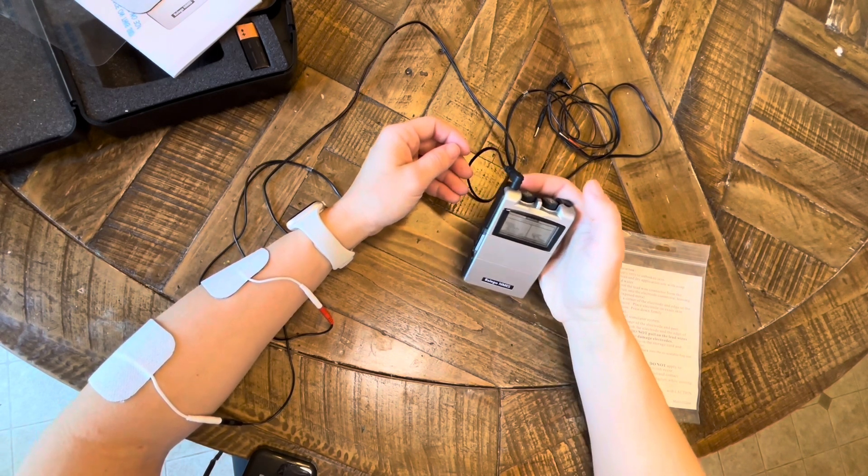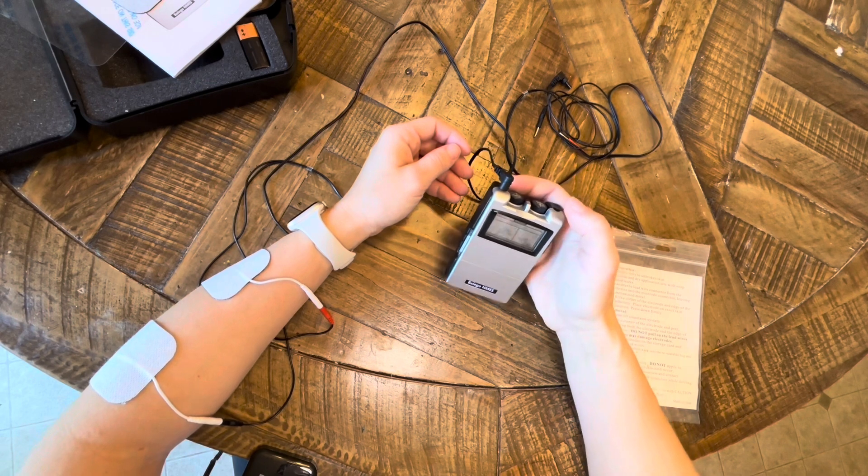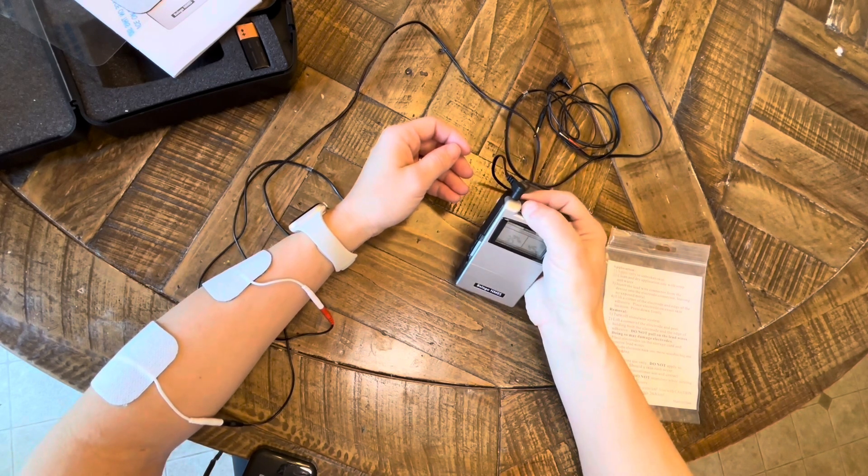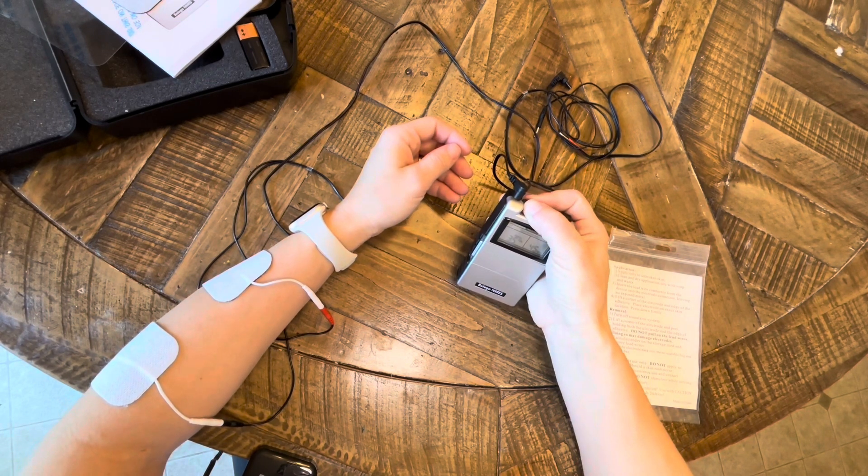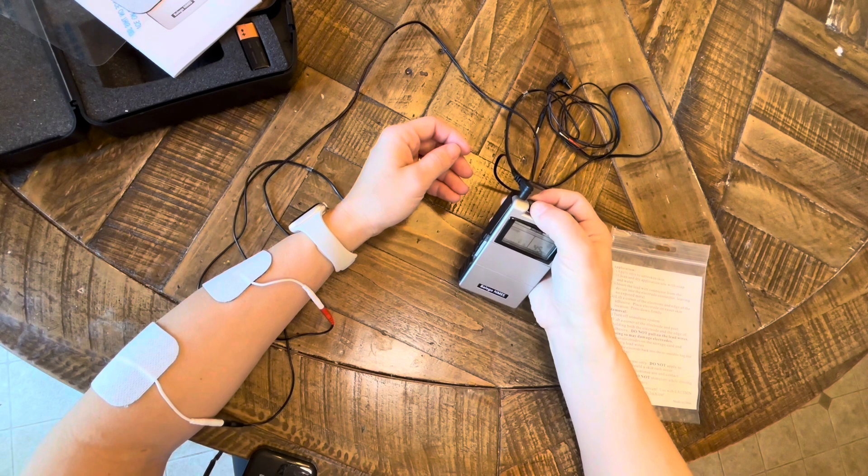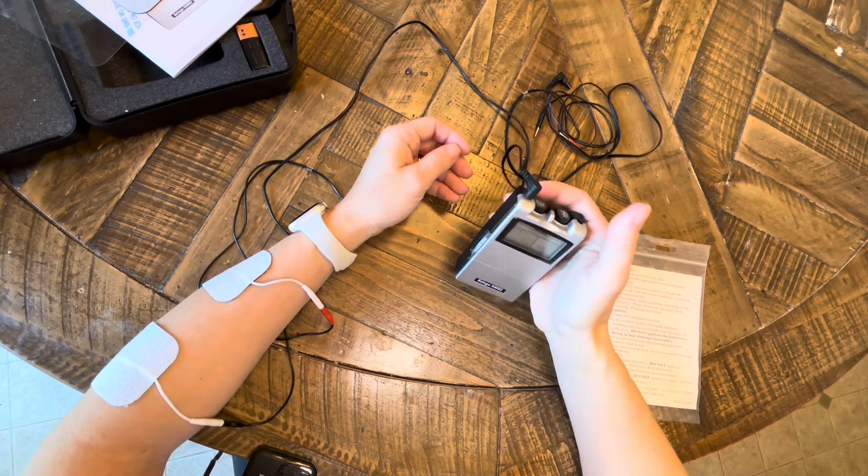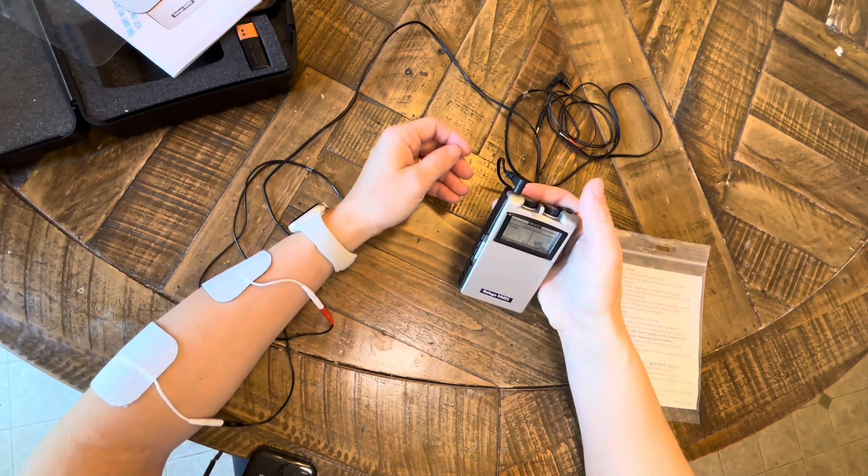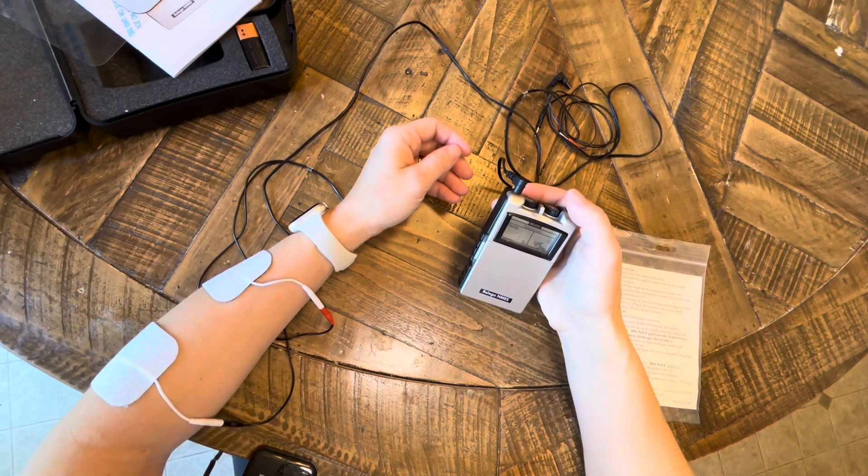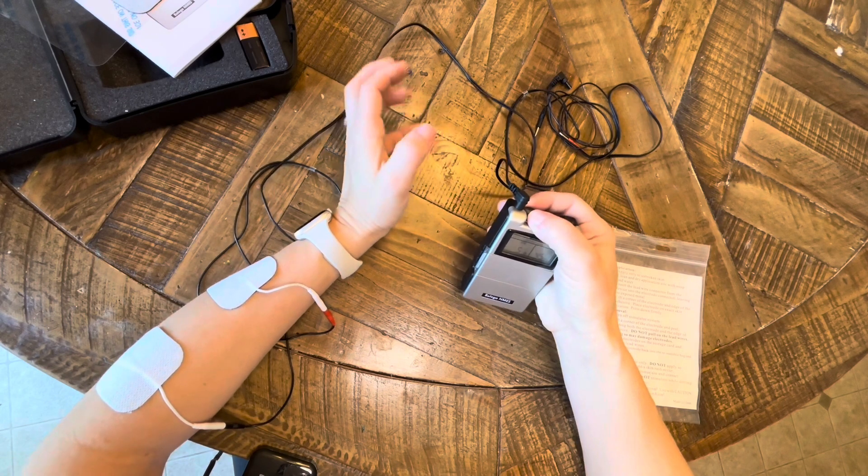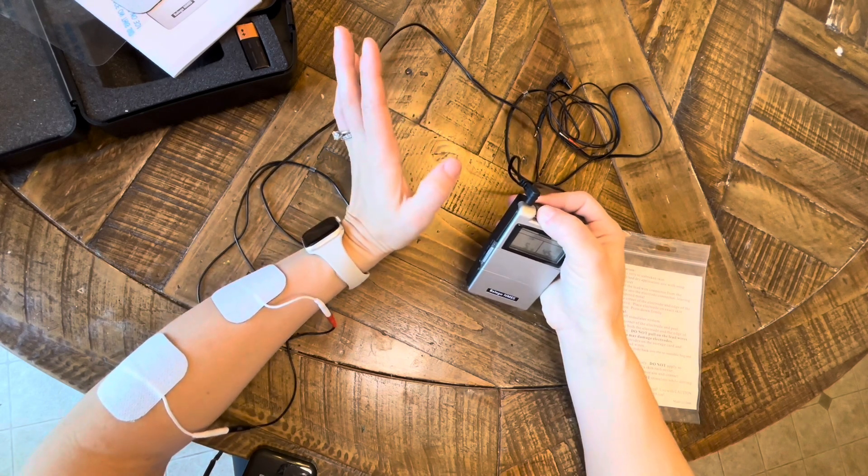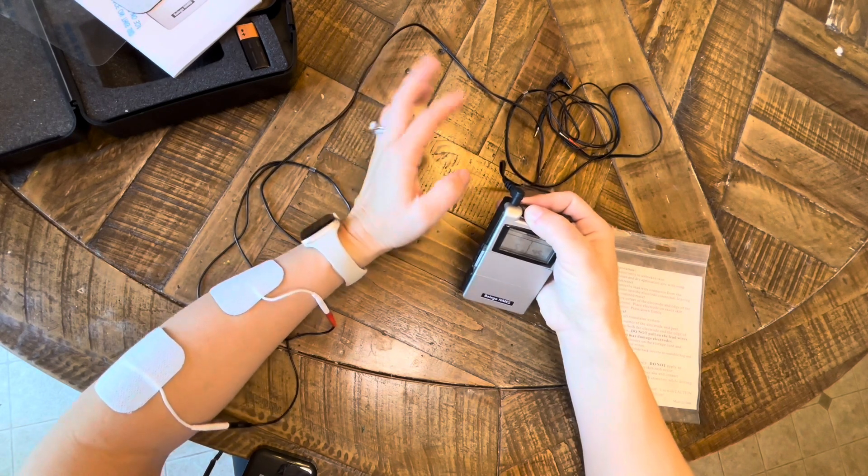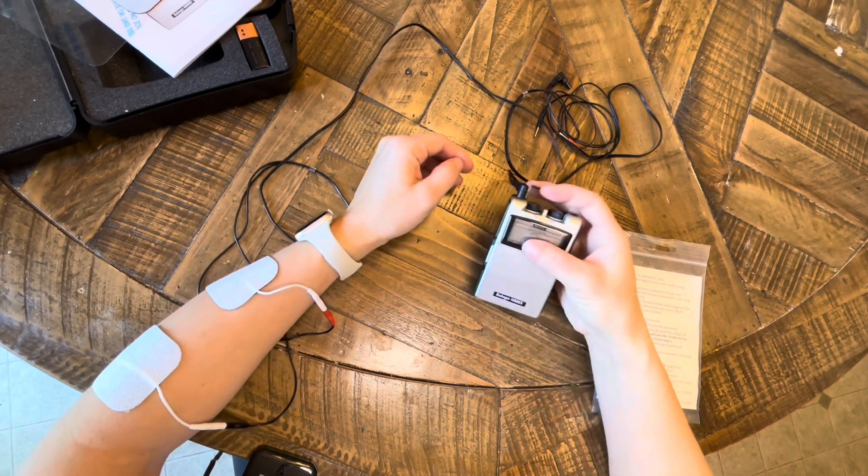When the e-stim is off I'm not going to turn it up, because I want to make sure I am getting just the right amount of e-stim intensity that I need to create the movement that I want.